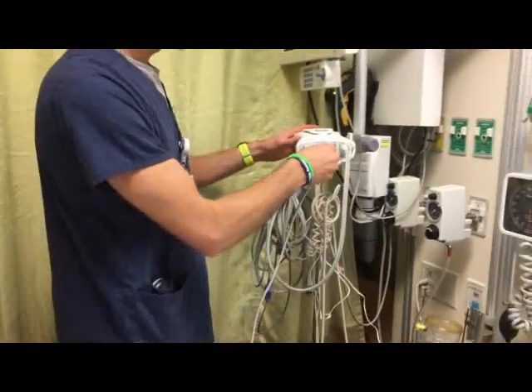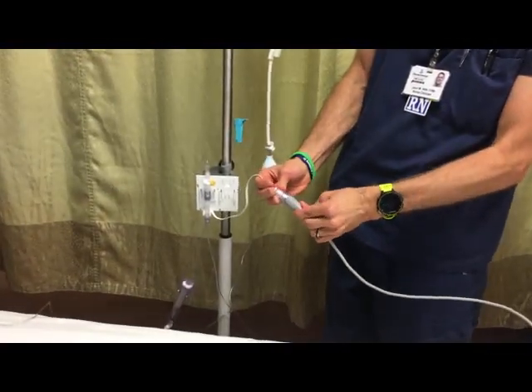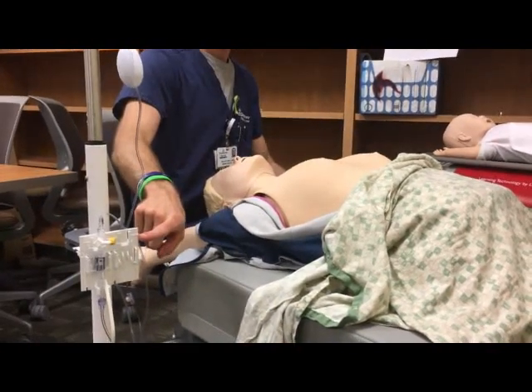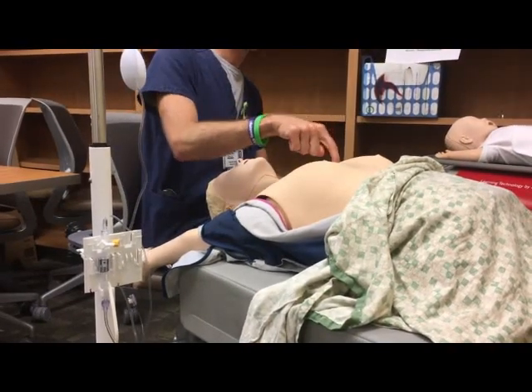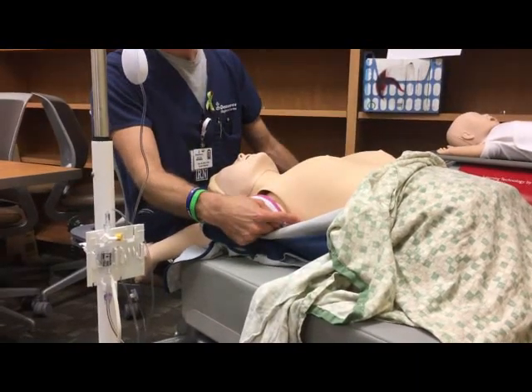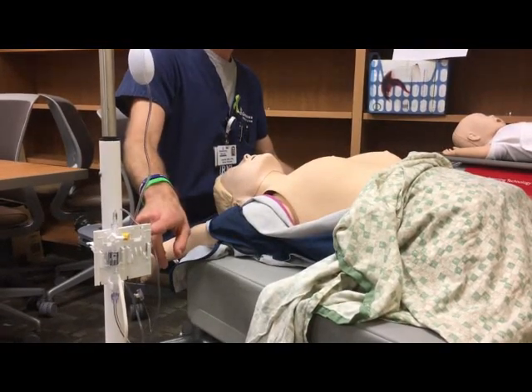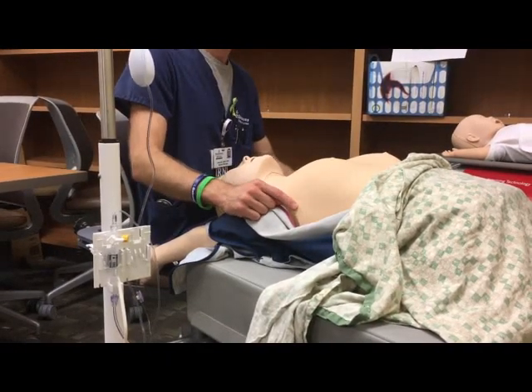Insert the red transducer cable into the patient monitor and into the jack of the transducer. In order to level the transducer to your patient, the air-fluid interface at the zero line of the transducer holder should always be leveled with the phlebostatic axis. To locate the phlebostatic axis, find the fourth intercostal space on the anterior chest and follow that laterally to the mid-axillary line — where those two lines intersect is the phlebostatic axis, which correlates anatomically with the heart. With any position changes, raise or lower the transducer holder to maintain the air-fluid interface with the phlebostatic axis, whether the patient is in a supine or semi-Fowler's position.